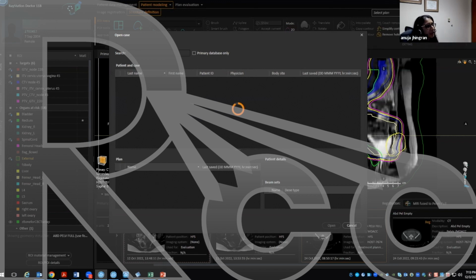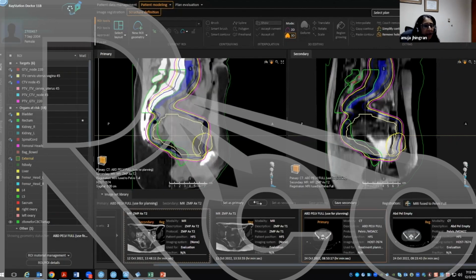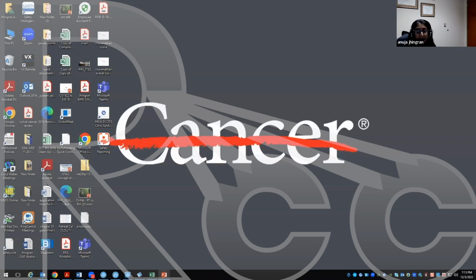I'm not going to get this. Sorry. It is an interesting case, and I was wondering, do you use an ultrasonography to do your brachytherapy to insert your tandem? Okay. Yes. Okay, I'm not going to quite get the other case, but I'll do it a different way, so let's just move on and then I'll come back to that. Yes, I did. Let's see if I can do this. I'm going to stop sharing for 1 minute, sorry.